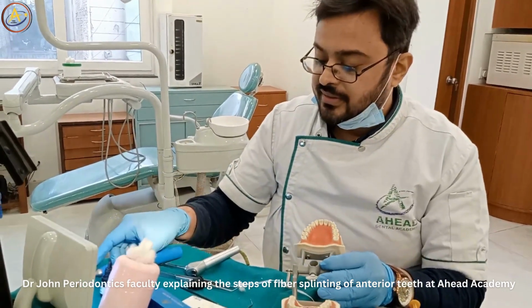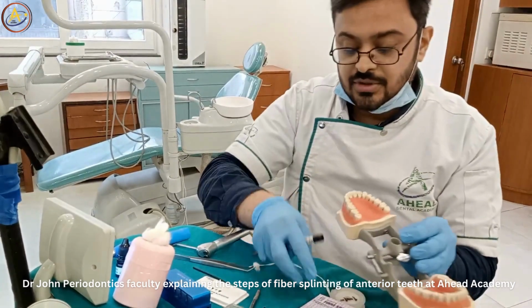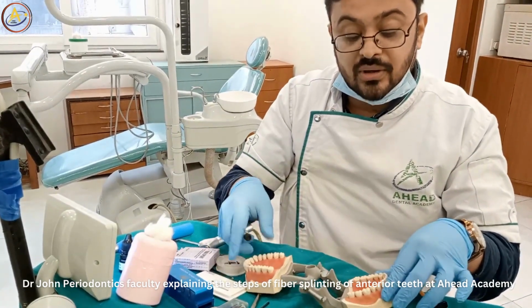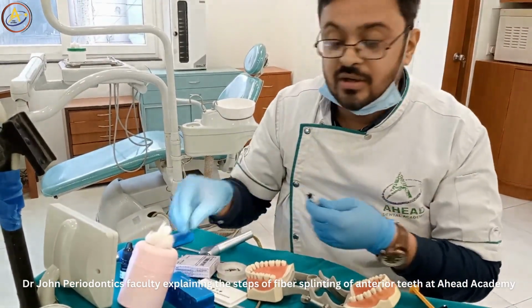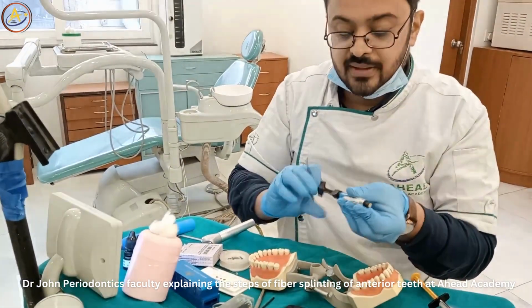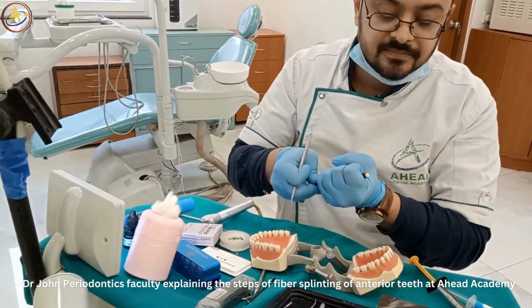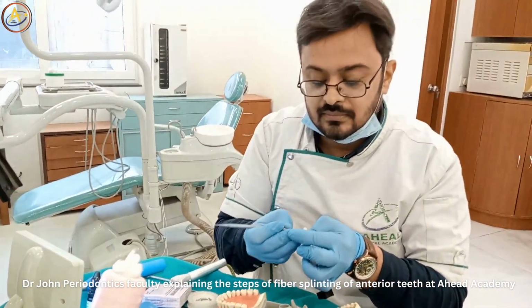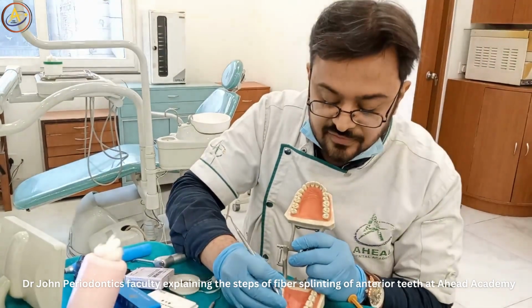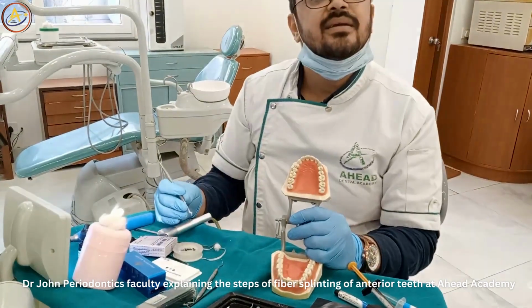Okay, now you see the main part, that is your composite. I am showing you the demo today of the packable composite because it is more difficult to cure and more difficult to trim. So in the first video I am showing you the packable composite demo. Okay, you take out the composite as you feel how much is required. First of all, we are giving a demo of your plain composite.